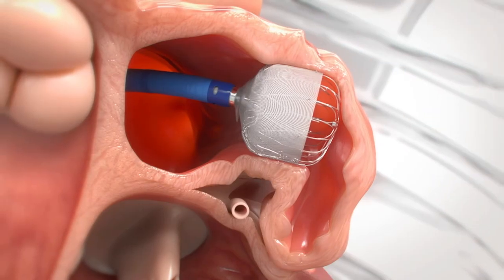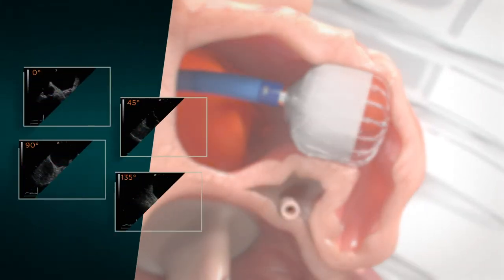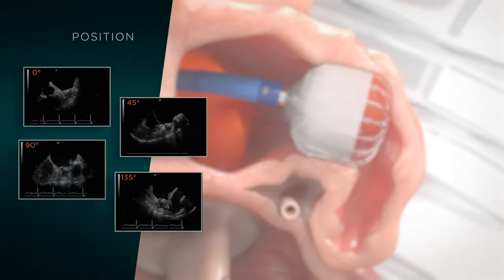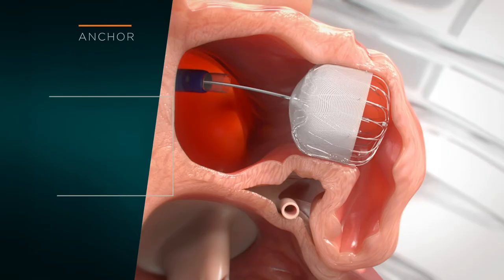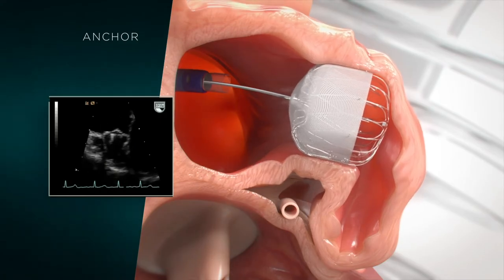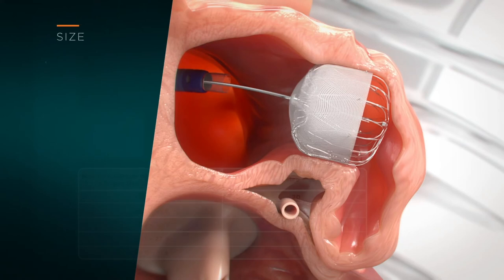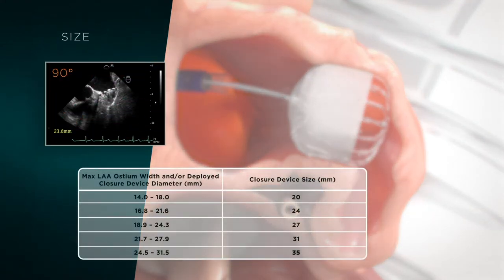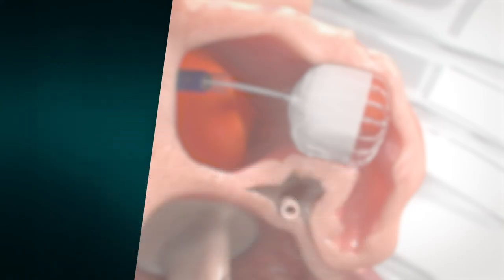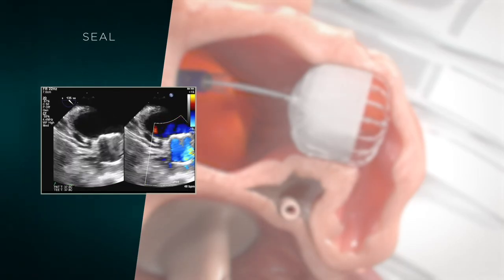Before final release of the device, the physician checks the pass criteria. Position: the device is flush against the ostial plane. Anchor: the fixation anchors are engaged and the device is stable as proven by a tug test. Size: the device is compressed to 10 to 30% of its original size. And seal. Using color Doppler imaging, the physician checks for residual flow around the device.